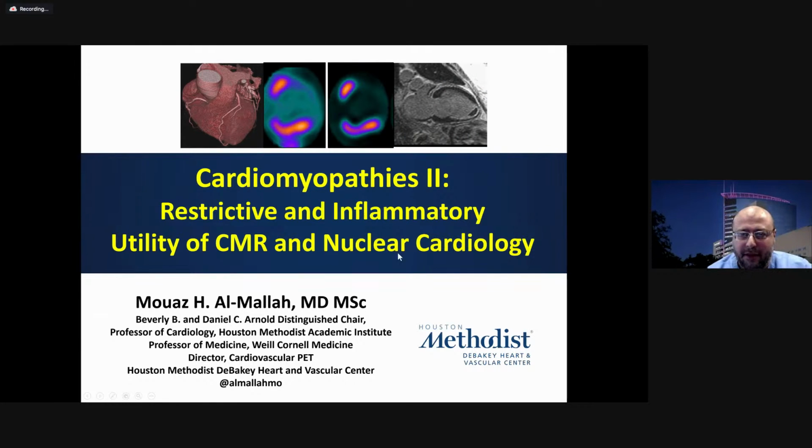Thanks, Dipan, for the introduction. If I was giving this lecture about 10 years ago, it would probably have been completely echo and CMR for assessment of cardiomyopathies. Nuclear cardiology was probably not involved in the assessment of these patients beyond ruling out coronary artery disease. However, over the past 10 years, there have been a lot of advances in the field of nuclear cardiology, which allow this modality to fill some unmet needs that are still required for the management of these patients.